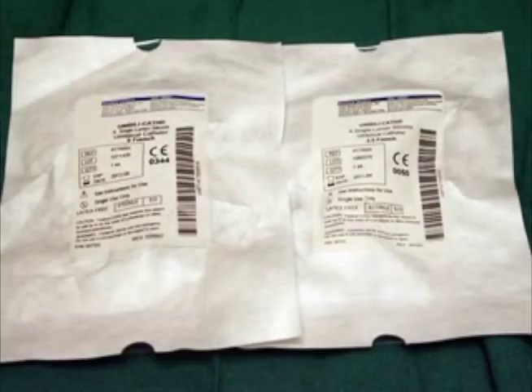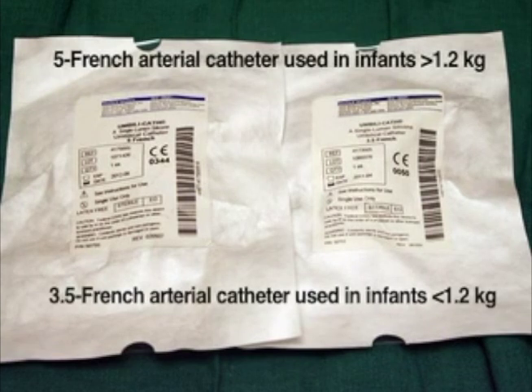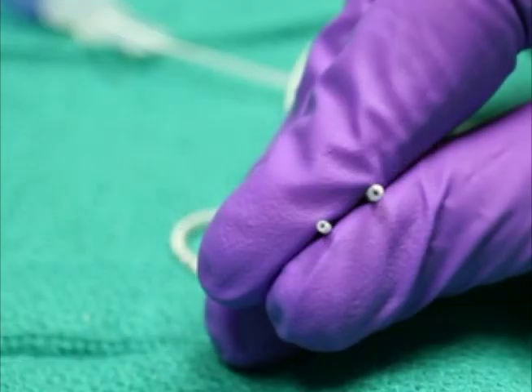There are numerous types of umbilical catheters from which to choose. A 5 French arterial catheter should be used in infants weighing more than 1.2 kilograms. A 3.5 French arterial catheter should be used in infants weighing less than 1.2 kilograms. Arterial catheters should have a single hole and be as non-thrombogenic as possible.